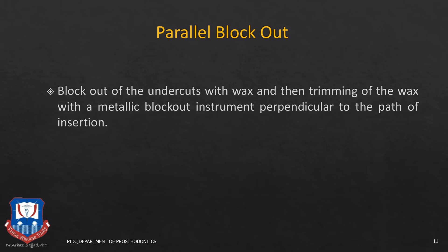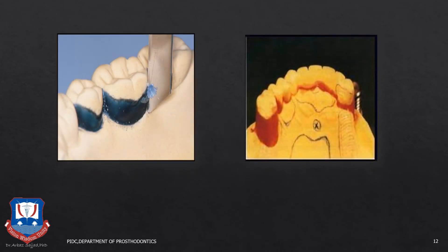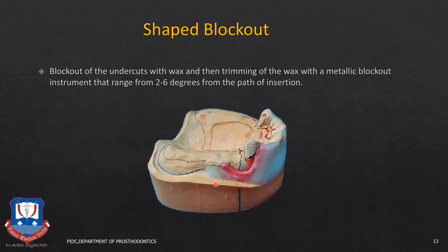In parallel block out, the undercuts on the teeth and the gingival crevices that are below the height of convexity of the tooth are blocked out with carving wax or inlay wax. The undercuts beneath the height of maximum convexity of the tooth are blocked out — usually undercuts for the proximal plates, for the retentive arm, below the reciprocal arm. This is also done using the surveyor, maintaining the master cast on the surveyor at the determined path of insertion using the tripoding marks.